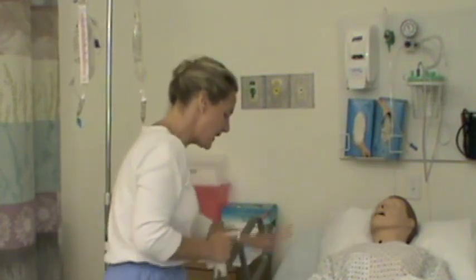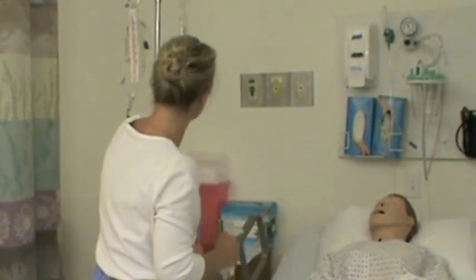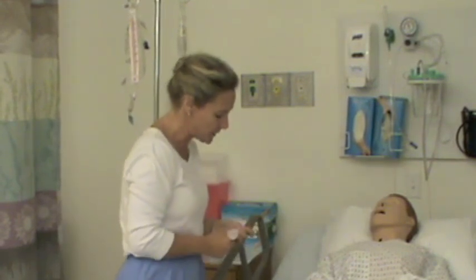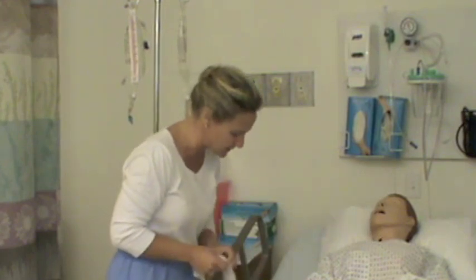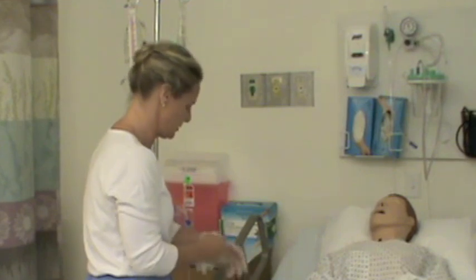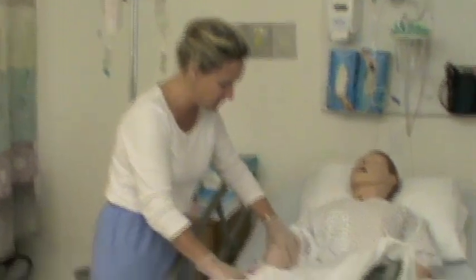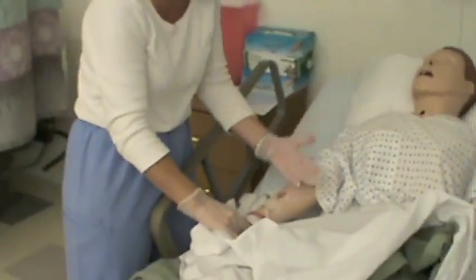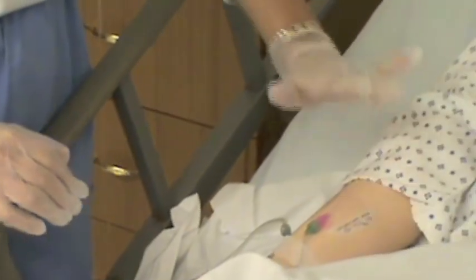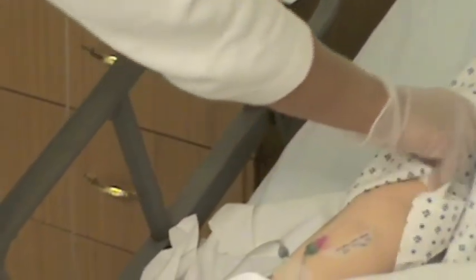Mr. Ito, what I'm going to do is — this IV site that you have right here, the tubing connected to it, the solution is almost done. So I'm going to hang new solution, and then new tubing because that's expired today. I'll take a quick peek at your IV site. You shouldn't feel anything — it shouldn't hurt at all. Looking at the site: no inflammation, no infiltration. It's warm to the touch — not cool like the solution. It's not swollen, so it looks like it's still working and continuing to drip, infusing well.